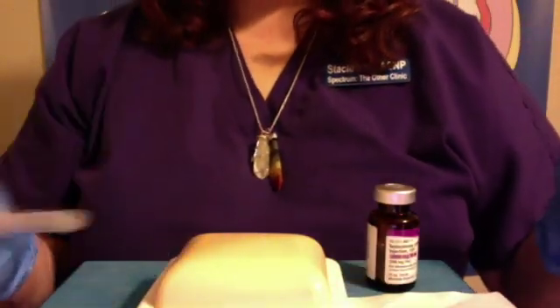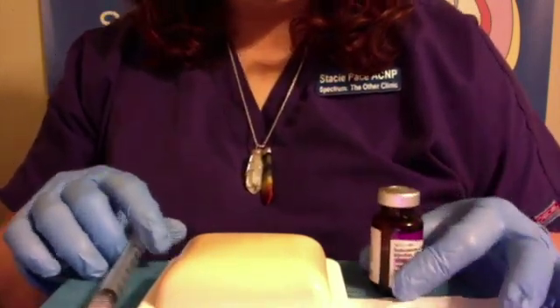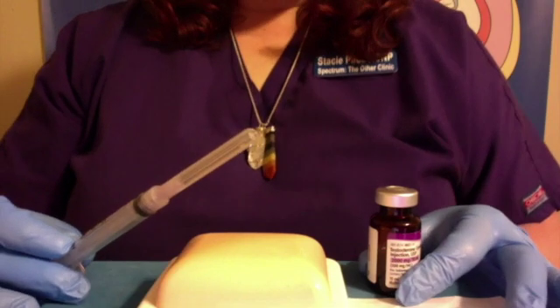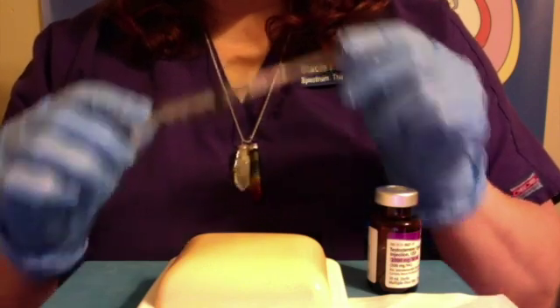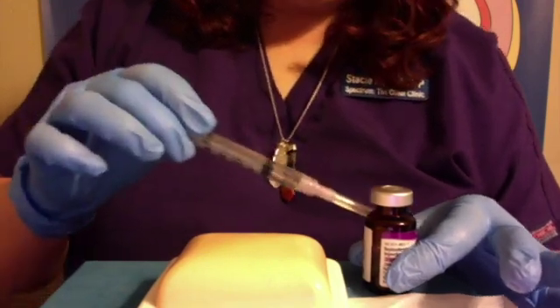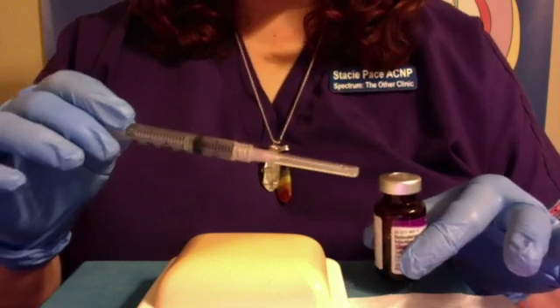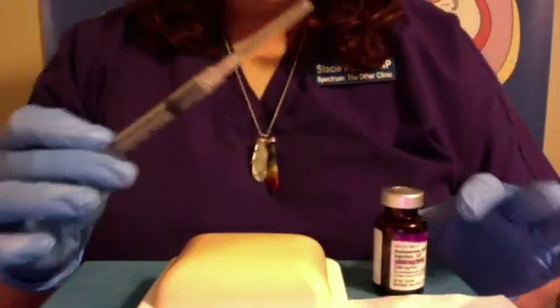We've got all of our equipment: our medication, our alcohol wipe, our skin site, and our needle and syringe. First thing to do is, whatever your dose is that you're going to be pulling out of your medication vial, you need to have that same amount of air pulled up in your syringe. Let's pretend my dose is one milliliter, so I'm going to pull up one milliliter of air. That air goes in ahead of the medication so it doesn't mess up the vacuum inside the vial. You can get some pretty nasty surprises — getting sprayed with medicine — if you don't put air in first before you withdraw.